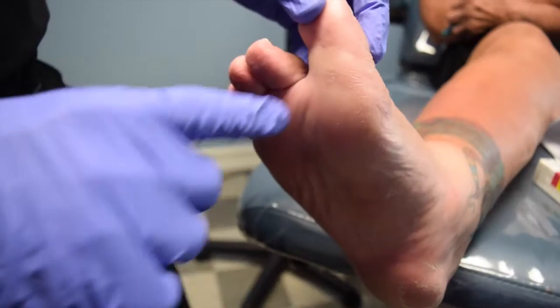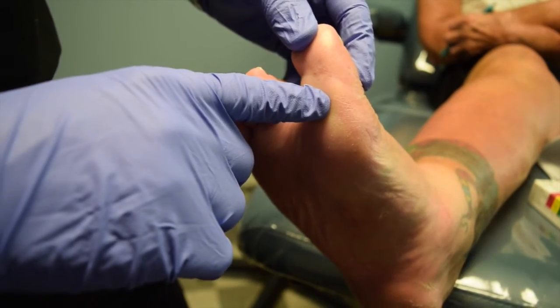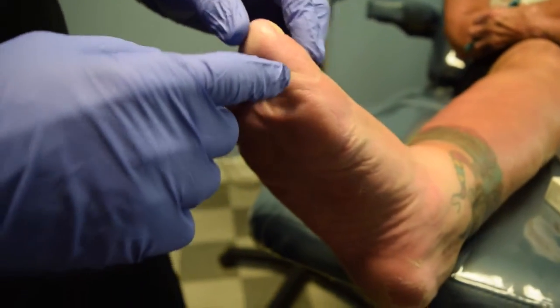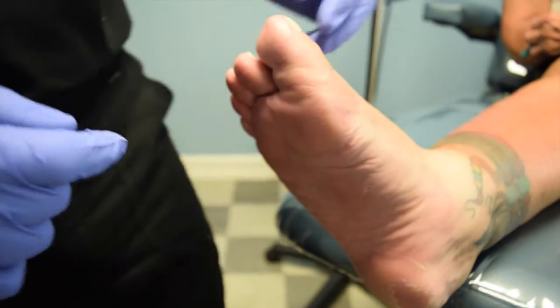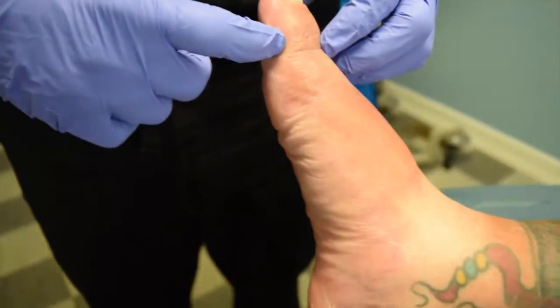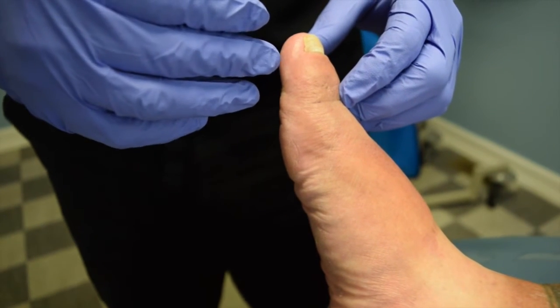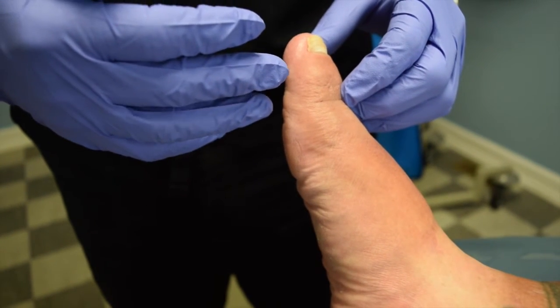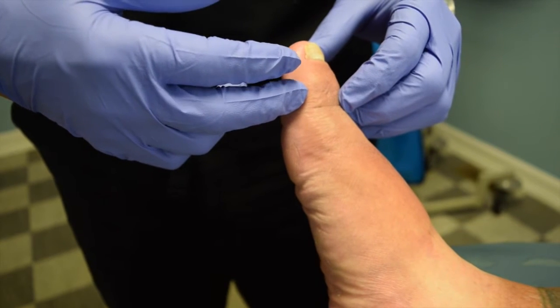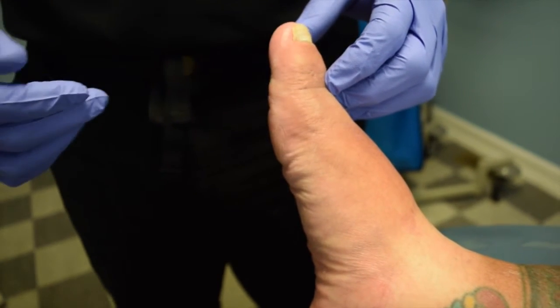To correct this, we performed a percutaneous surgery where we basically did a flexor tenotomy. We also went into her foot under fluoroscopy on the side of her foot through a percutaneous incision in the proximal phalanx and performed the procedure like the Aiken Osteotomy, but performed it slightly differently where we actually used the burr to denude out the infected osteomyelitis.